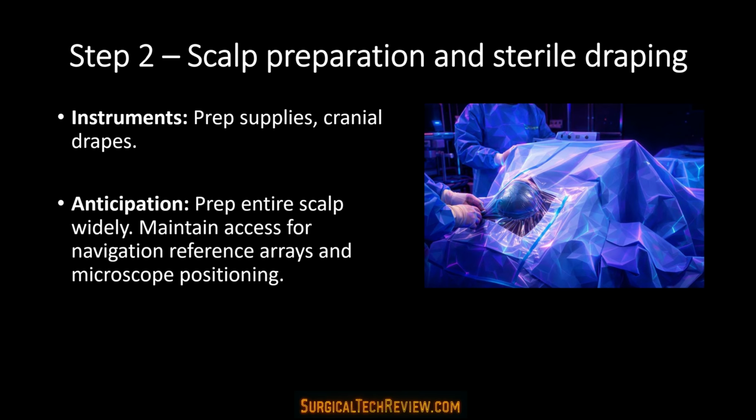Step 2. Scalp preparation and draping. The scalp is prepped widely and sterile drapes are applied. Care is taken to maintain access for navigation equipment and the surgical microscope.